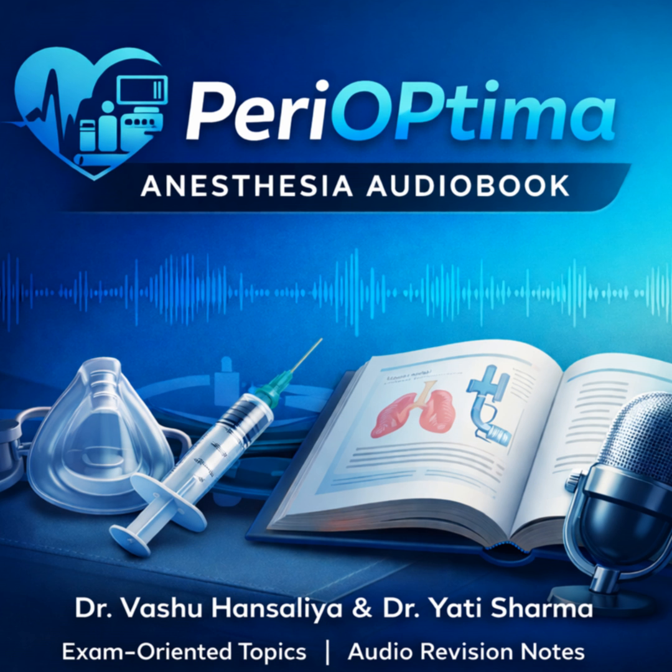Okay, let's transition into the numbers and pressures, the physiological context that determines the safety margin. First, how do SGADs affect ventilation dynamics? They're very versatile. They permit both spontaneous ventilation and controlled positive pressure ventilation, or PPV. A known benefit is that using an SGAD is associated with reduced gastric distension compared to what you might see with aggressive bag valve mask ventilation alone, because the SGAD provides a relatively sealed conduit.